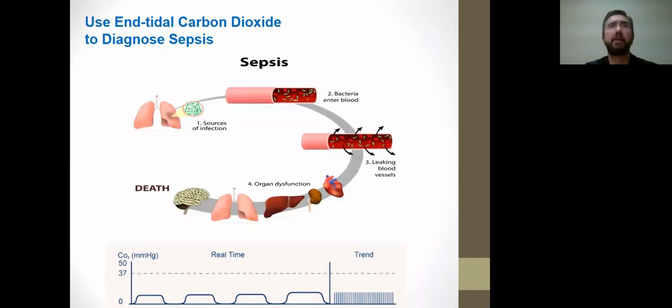Severe sepsis is characterized by poor perfusion, okay, leading to a buildup of serum lactate, resulting in metabolic acidosis. So end-tidal CO2 levels decline in the setting of both poor perfusion and metabolic acidosis. To compensate for metabolic acidosis, patients increase their minute ventilation, right? So this increased respiratory rate blows off carbon dioxide and lowers the end-tidal CO2. At the same time, poor tissue perfusion decreases the amount of blood flow to the alveolar lungs, reducing the amount of carbon dioxide that can be exhaled.